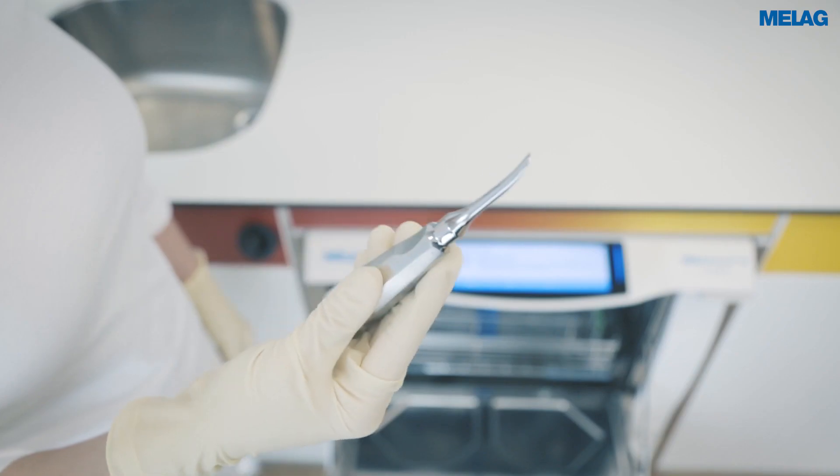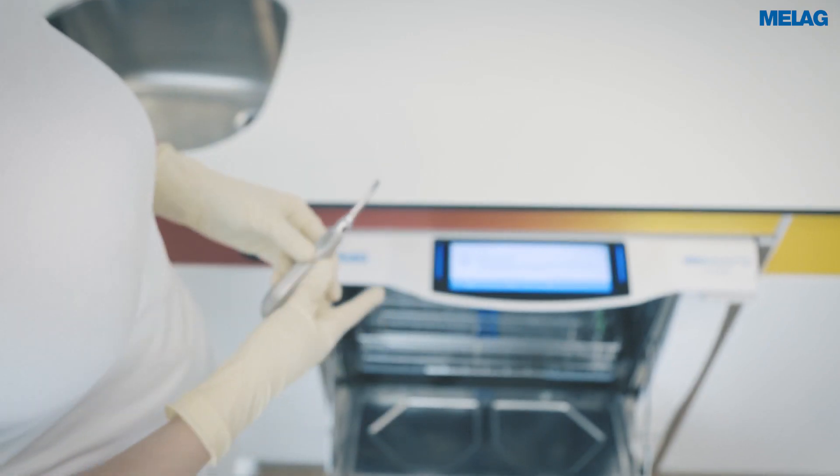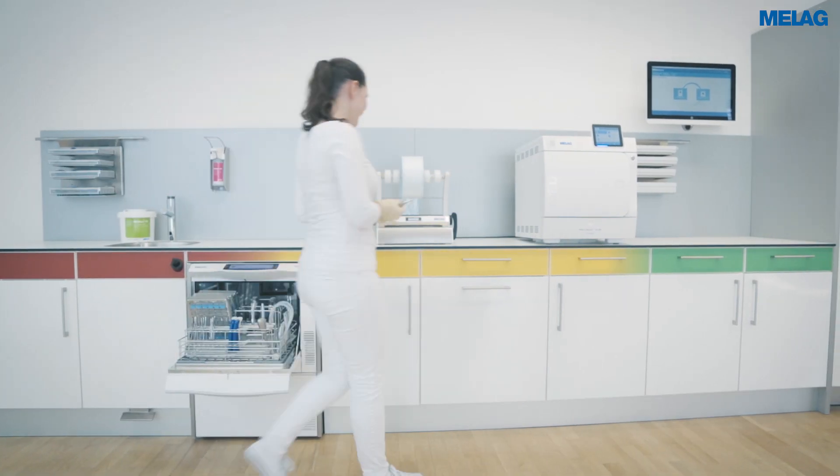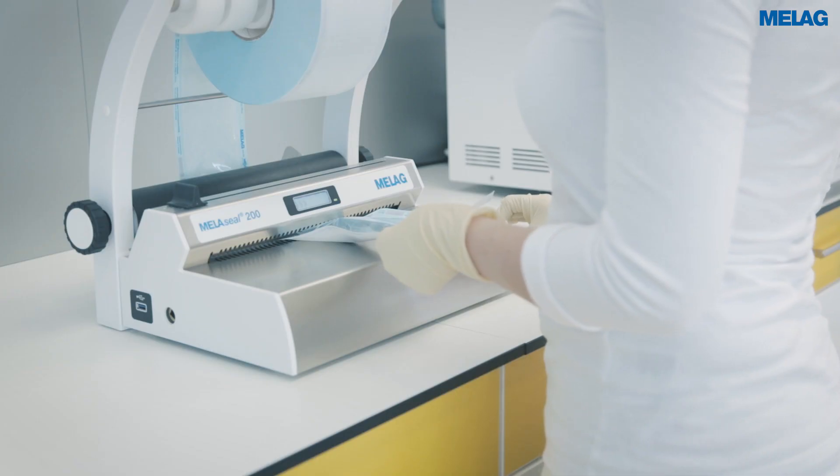After performing a careful visual check of the instruments, the approval is completed by pressing the Yes button. Surgical instruments have to be wrapped and sterilized.